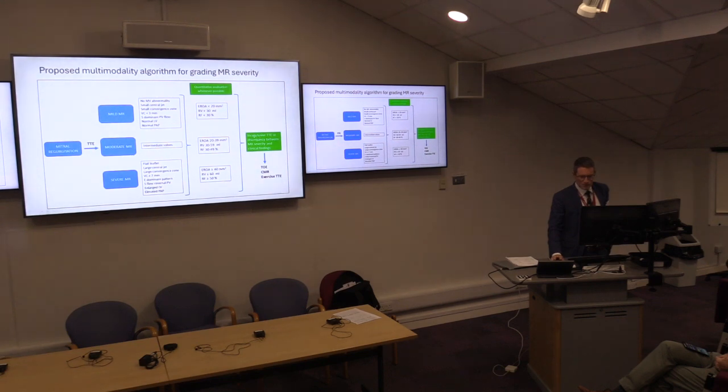But the point of this is to say that actually, not dissimilar to what I told you for the aortic valve, if you've got a patient in front of you who's breathless and you can't explain it any other way, and you've not seen good enough quality images, have a very low threshold to ask someone like me to do a TOE. And if the TOE still doesn't give you a clear answer, then think about other modalities, particularly for mitral valve.